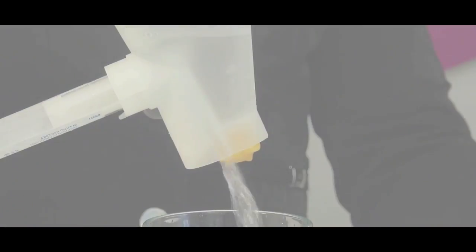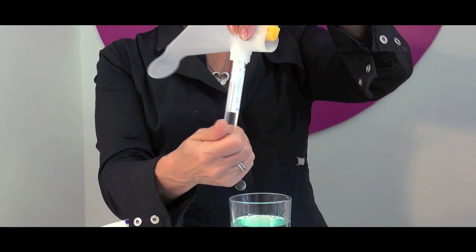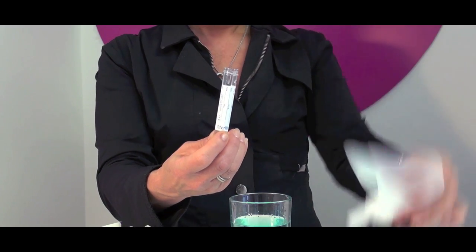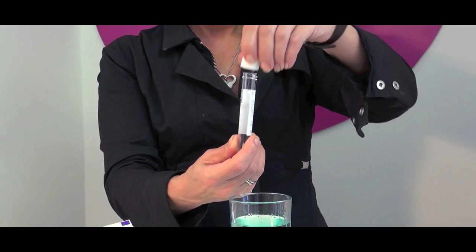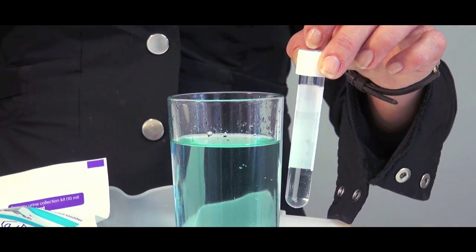It works with both high and low urine flows, from 40 to 10ml a second. When you've finished, count to 10 to allow the sponge to drain, and then simply lift PZ away from the body, remove the bottle, replace the lid, and dispose of the funnel into the clinical waste bin provided.